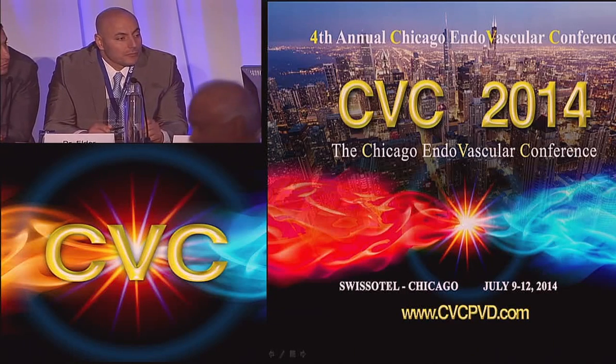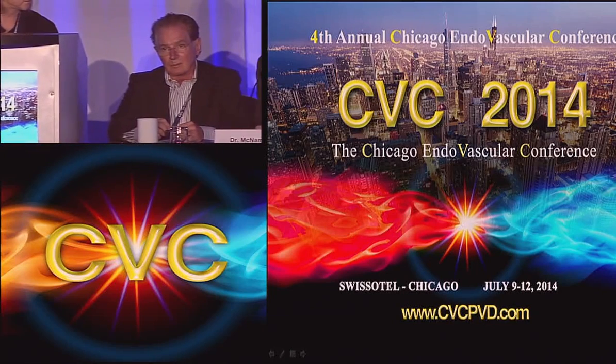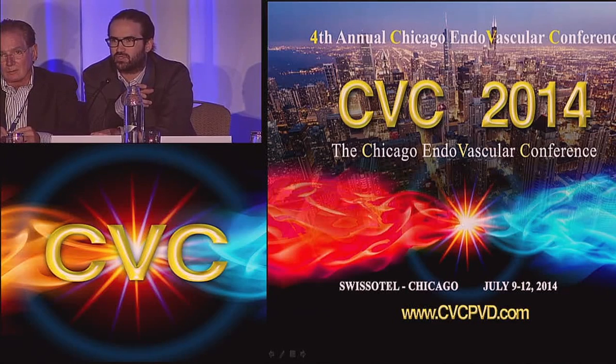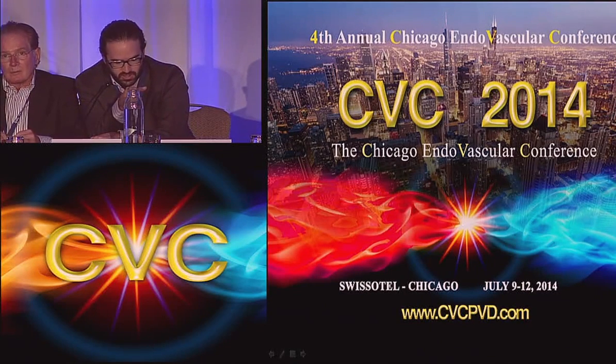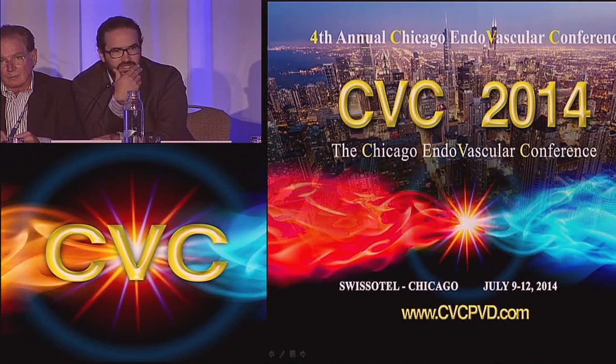Thank you. I actually have a question I wanted to pose to Dr. Lin. It was in regards to once you have your ECOS catheters in, and as we spoke in here, there are all these hemodynamic parameters we could follow, including the patient's response to the FiO2, how their vent management starts getting better, and their bedside echo could be better. My question, and probably also to the rest of the panel, is: do you take them back for an angiogram at 12, 24, 48, whatever hours, or do you just, based on the betterment of the clinical aspect, pull the catheters out bedside in the ICU and then allow the team to take over?